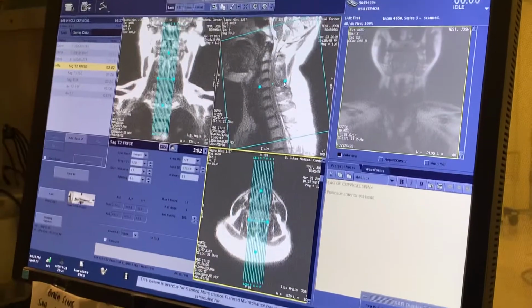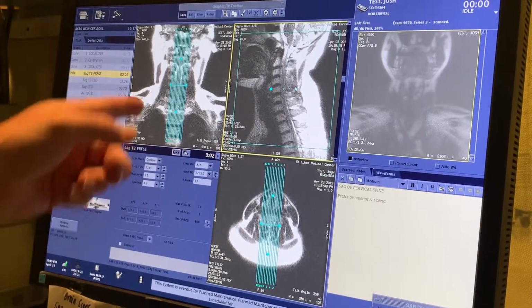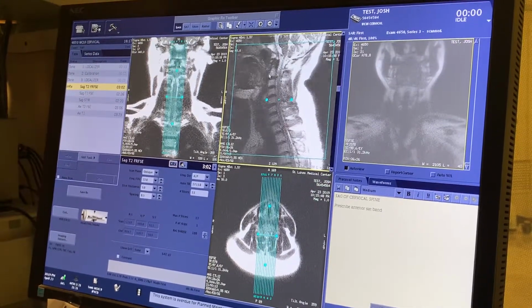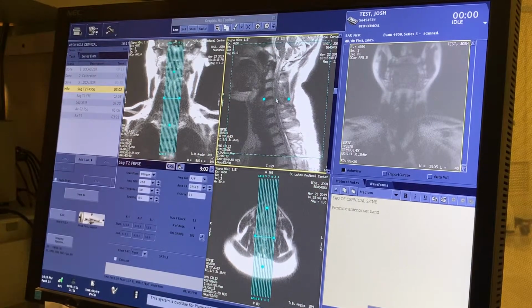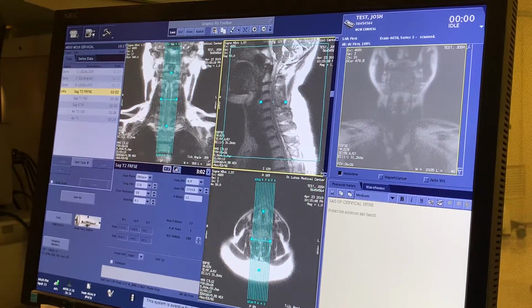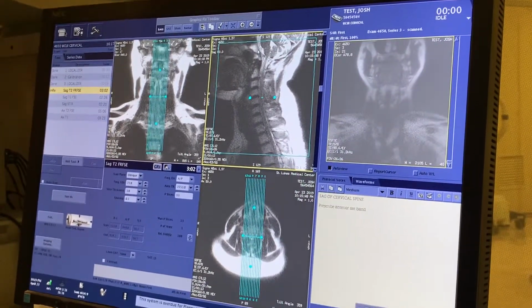and the cervical spine. I'm going to angle this straight because it's angled because I prescribed it off of that window there, and then move this. All right. Next thing I'm going to do is my centering, and I'm going to center so that this is the pons, so that the top of the slice goes right through the pons, so I include the clivus, which is right here on my scan.